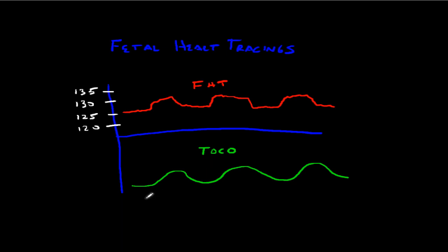There's a few essential components that you really need to include when you're talking about the fetal heart rate tracing. The first one is going to be the baseline. Your baseline is just that. What is the average fetal heart rate on the tracing? And what you need to have is approximately 2 minutes of this baseline. So it needs to be describable for about a 2-minute period in any 10-minute window.